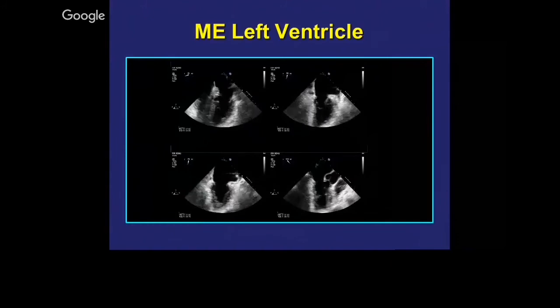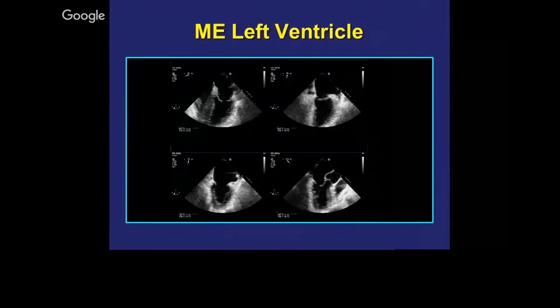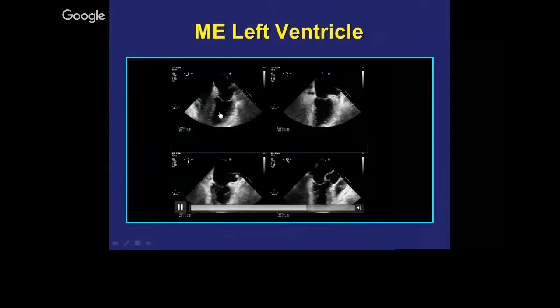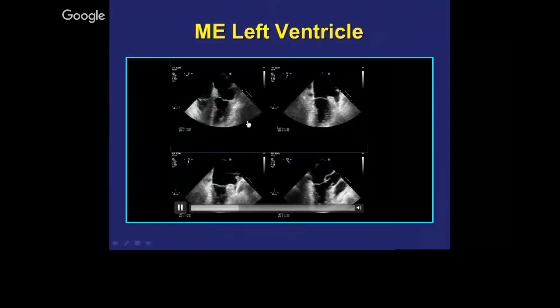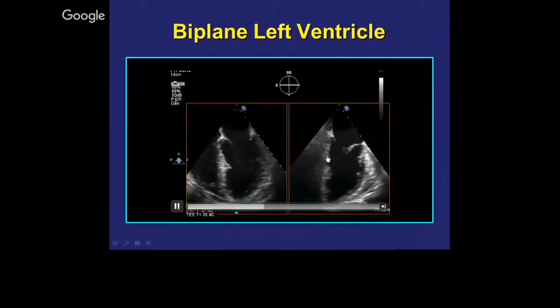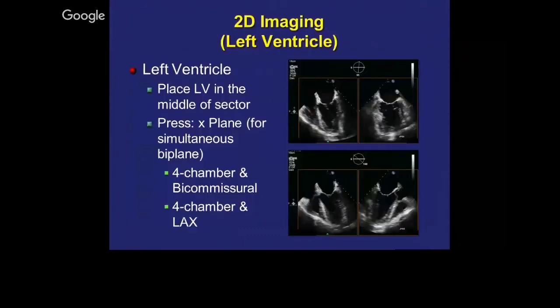3D TEE helps us to take multiple views of the left ventricle with biplane imaging. You can have images that are 90 degrees from each other on the same screen. You have your four-chamber view and you have the two-chamber view because you have orthogonal planes — that is what 3D has provided for us.